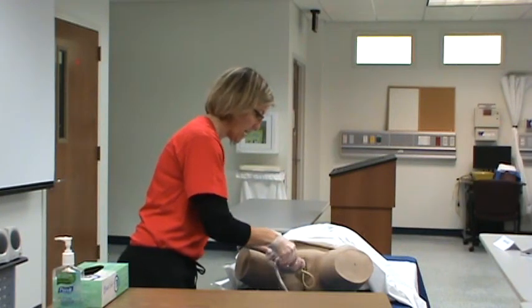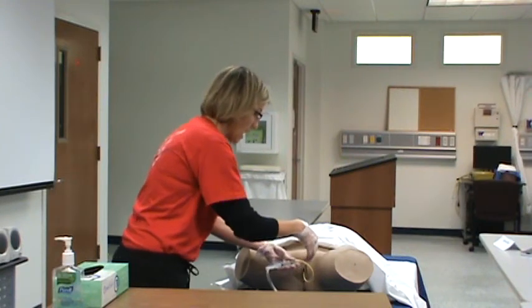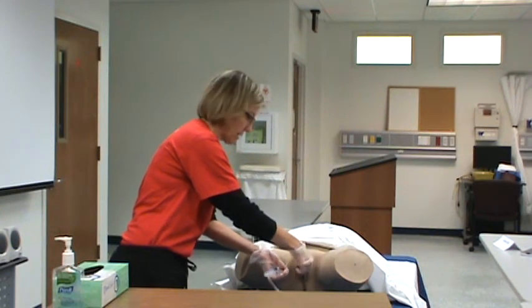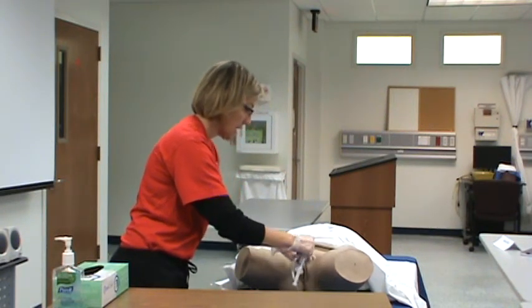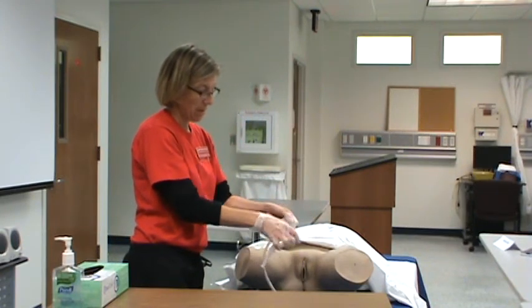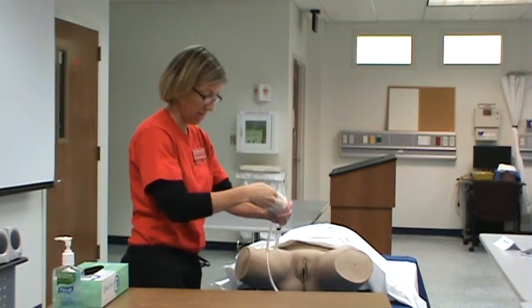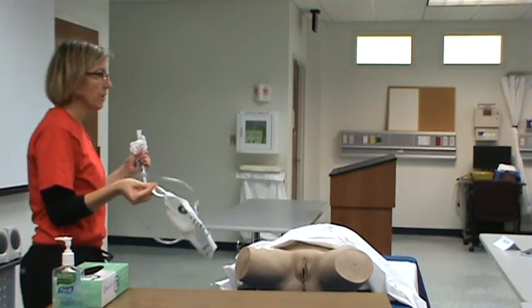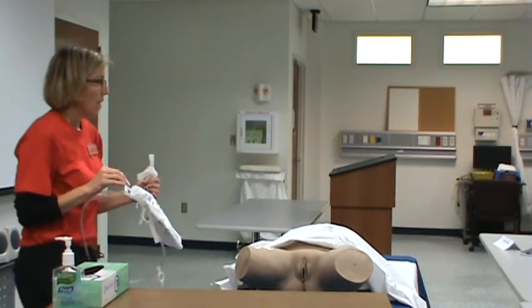All right, and then this one's, I'm sure now it stays on. Now I just release it. I tell her to take a deep breath because again it distracts them. Take a deep breath, Mrs. Smith. I'm removing your catheter, and she does. And then I've got the catheter itself wound up into this glove. I wind it up into that glove. I take note, 400 cc's of urine, and then I'm going to chart that.